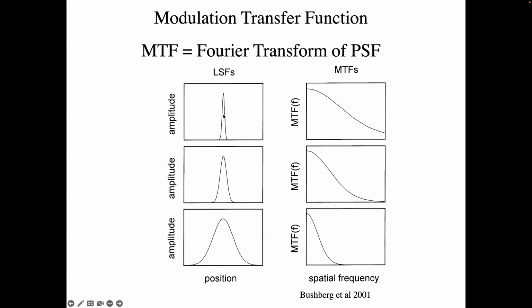And normally the way that's done is it's in millimeters, and you just go to the half height of this point spread function, measure the distance across it, and that's the full width at half max of the point spread function. So that's in millimeters, and it's a very easy thing to understand, right? It's just like, oh, my point spread function is 1.2 millimeters full width at half max. Most CT scanners, it's around 1 millimeter, right? Somewhere in that order. It's not 10 and it's not 0.1, it's around 1.